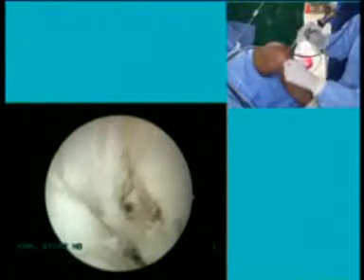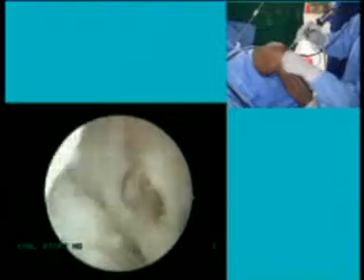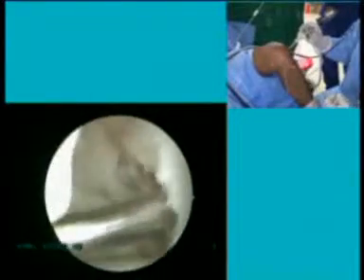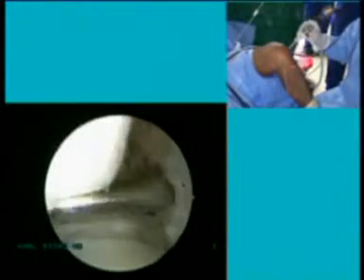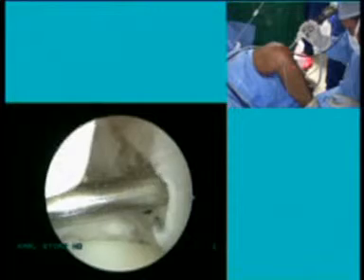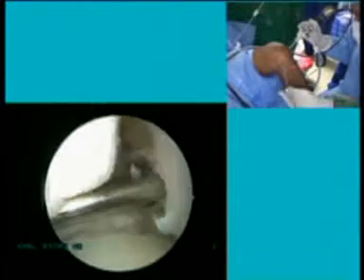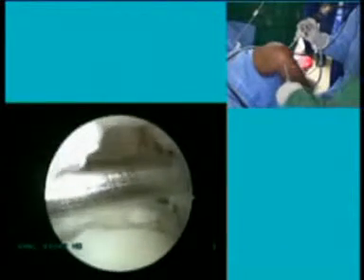So only the semitendinosus in it, because I like to leave the gracilis tendon intact because it has some function. Okay. Can you show this again? These tunnels are diverging tunnels, not converging tunnels. Do you have a graft diameter already?